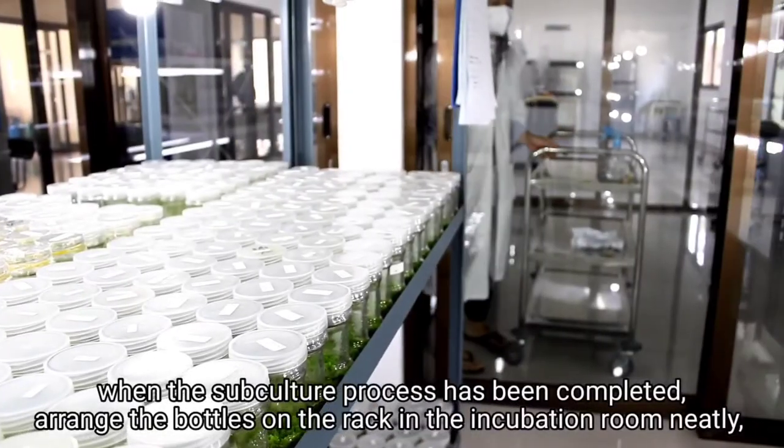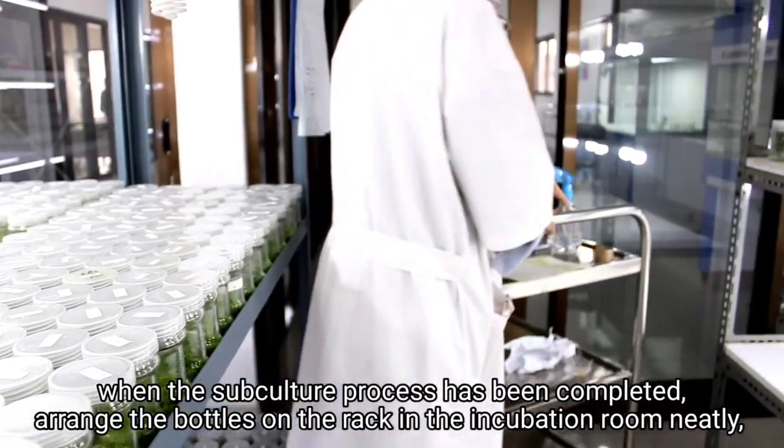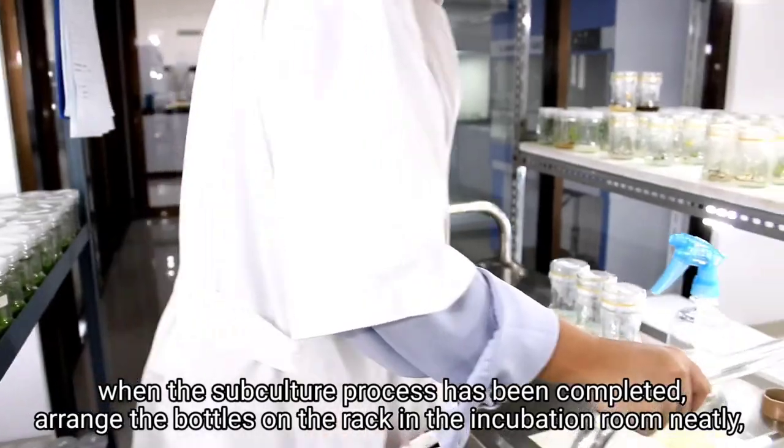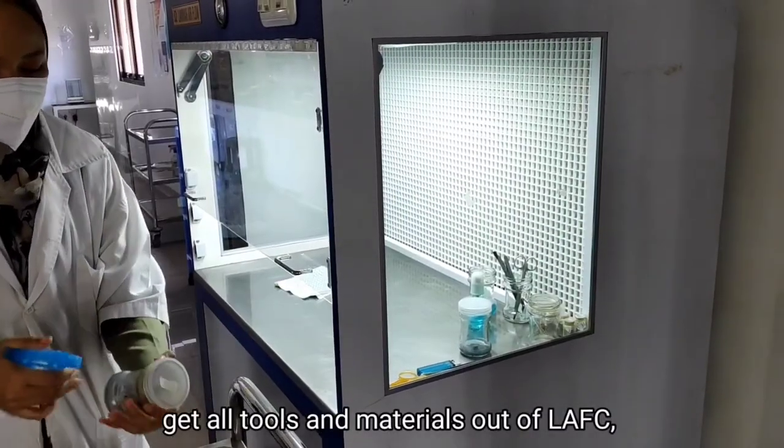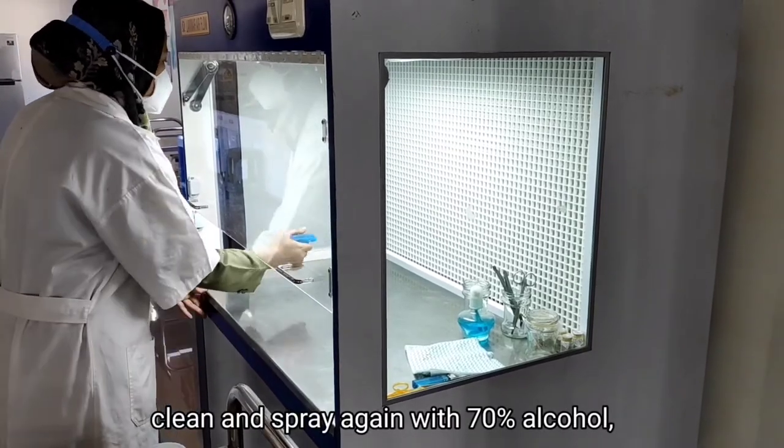When the subculture process has been completed, arrange the bottles on the rack in the incubation room neatly, using the trolley wrap to carry the subculture results. Get all tools and materials out of LAFC, then clean and spray again with 70% alcohol.